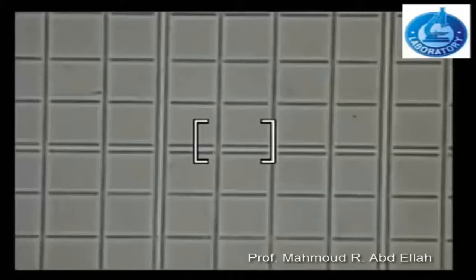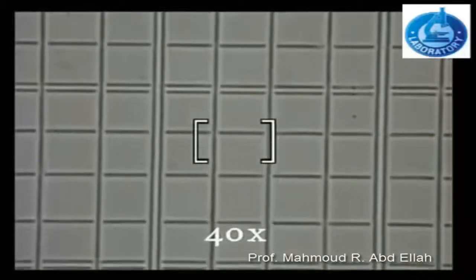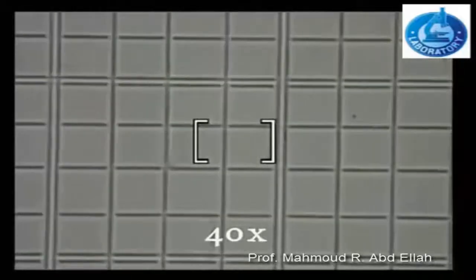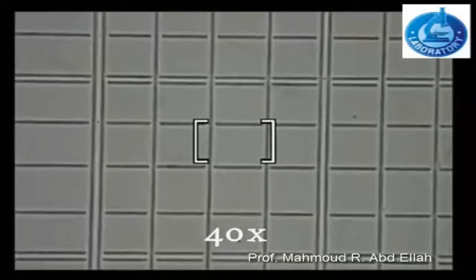Only one square from the 25 squares present at the central area appears under the microscope at 40x magnification.